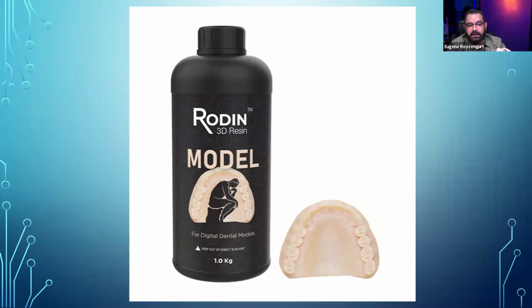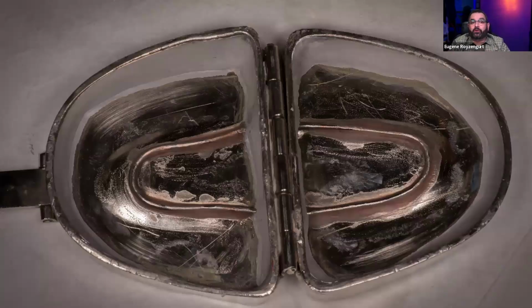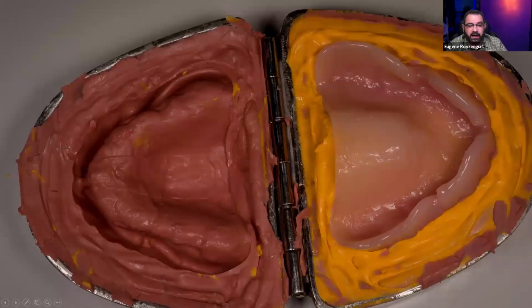Okay. Now, if you are doing, for example, a duplicate denture technique, we've been doing a lot of these over the years, and I started off doing the analog version of these, and I used to use these little flasks. They're lab duplicating flasks, and as you can see right here, I actually blocked out the undercuts with some stone and some acrylic, because the way I used to do it is I would put silicone in there, do one side, place the denture, and then do the other side.